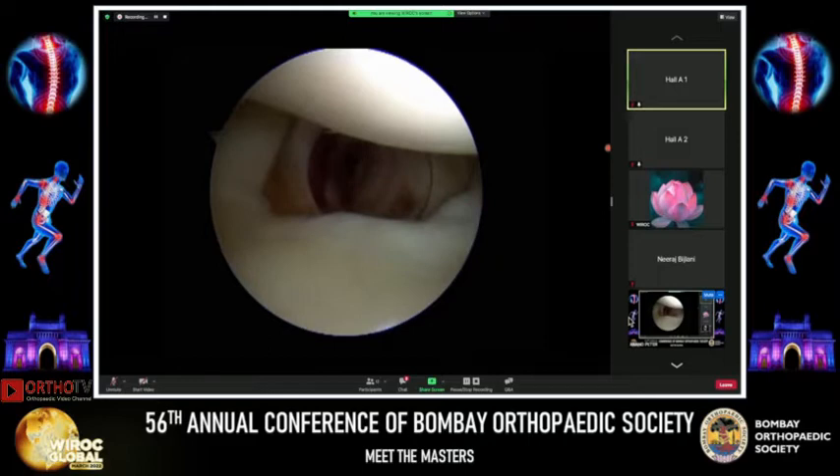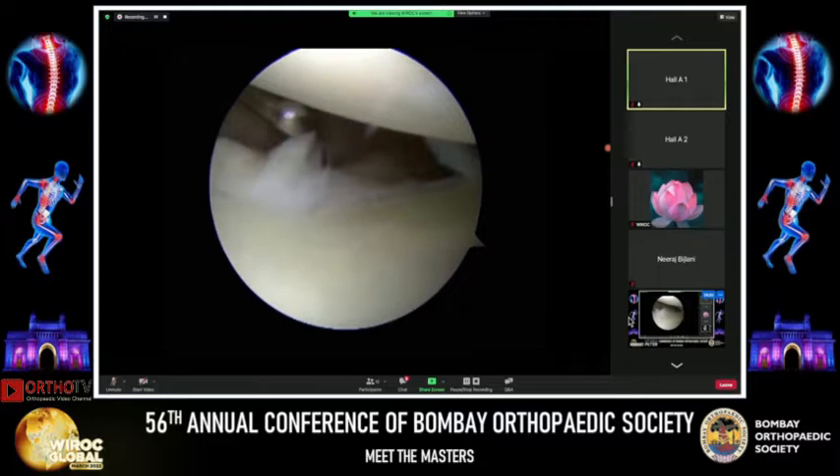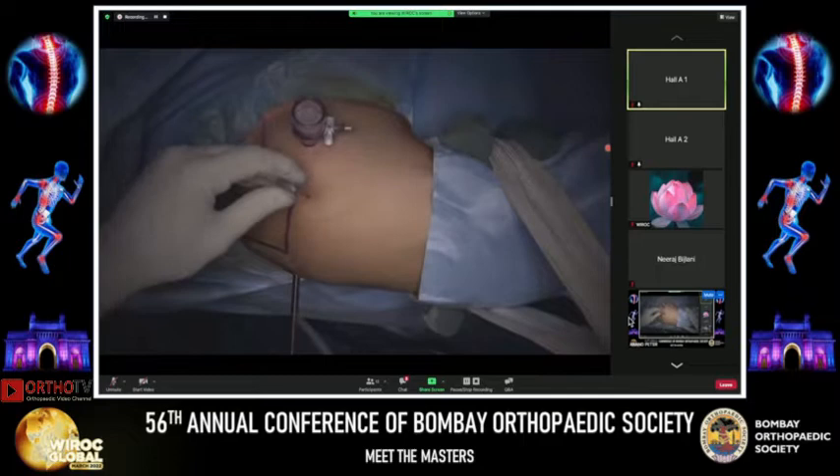I then use the probe to look for two things: the lesion and the tear. The probe goes in between the glenoid labrum and the glenoid — that's the tear. I also check whether this patient has a superior labral tear, because sometimes you can't identify it on diagnostic arthroscopy alone.